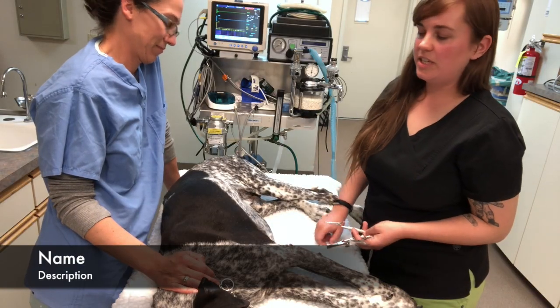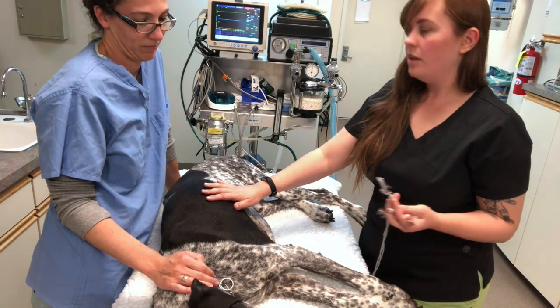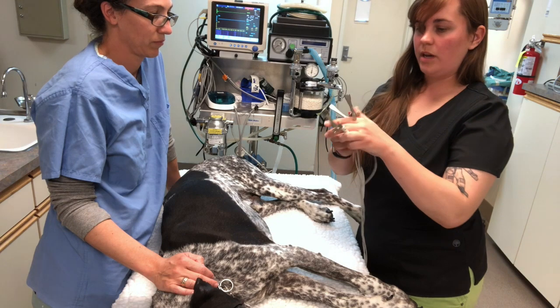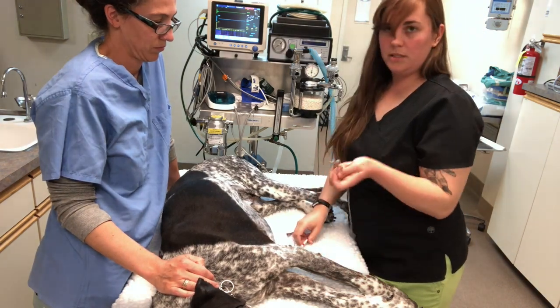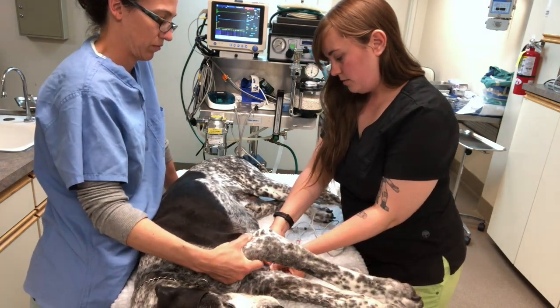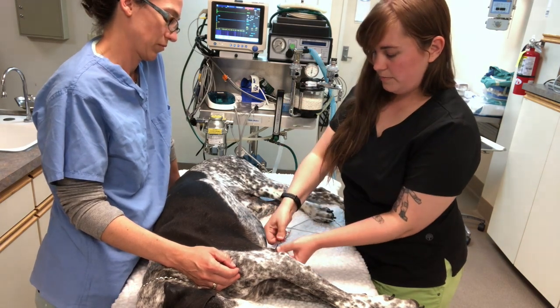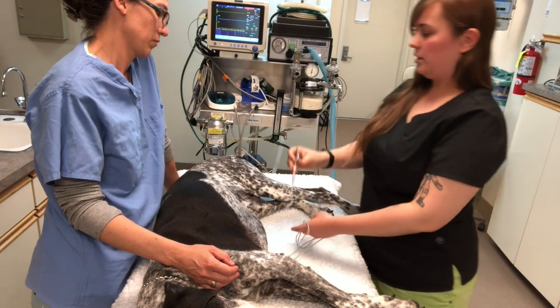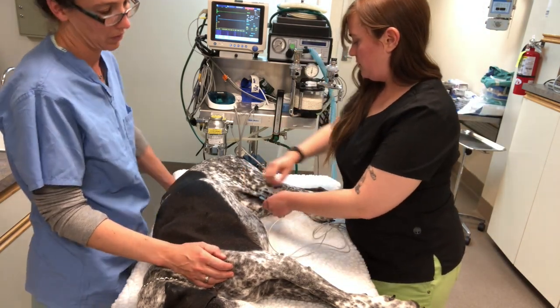For ECG reading, we want our patient in right lateral recumbency, which is where we have Austin right now. We have a 3-lead machine, so I'm going to hook up our leads. We have a right arm, a left arm, and a left leg. Our white is our right arm. I'm going to place it on the front, right at the elbow. Our black is our left arm, right there at the elbow, and then our red is our left leg, which goes right about the stifle.